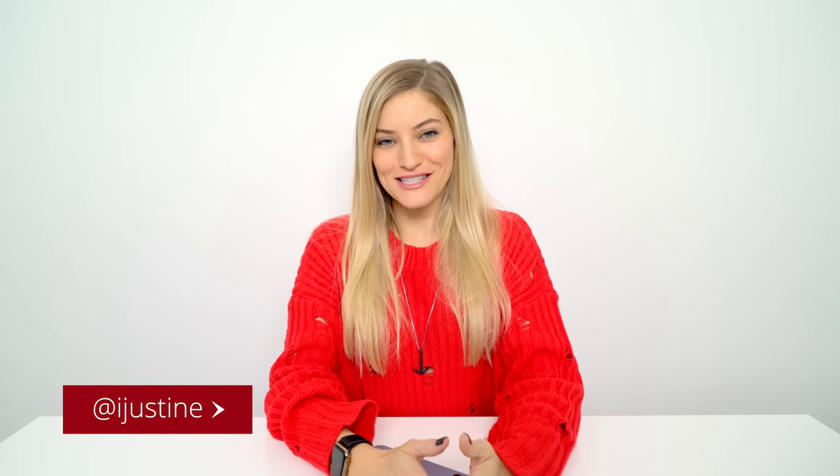Hey guys, it's Justine, and today I am so excited because the new ECG feature on the Apple Watch was recently released, and this is something that I've been waiting for since the Apple Watch officially came out. This is the Apple Watch Series 4, and this is only available on the Series 4.